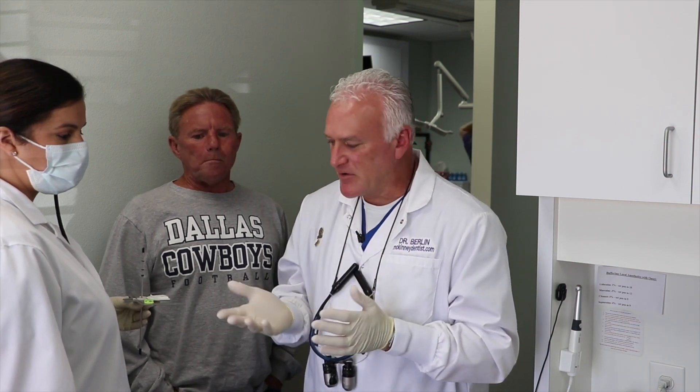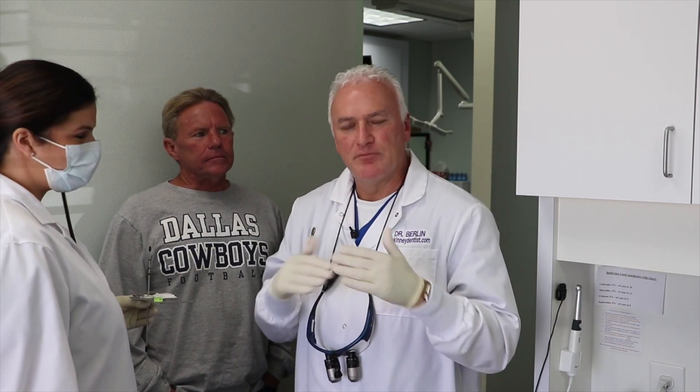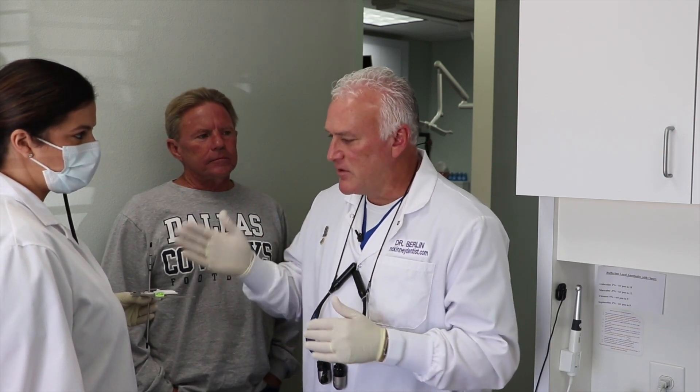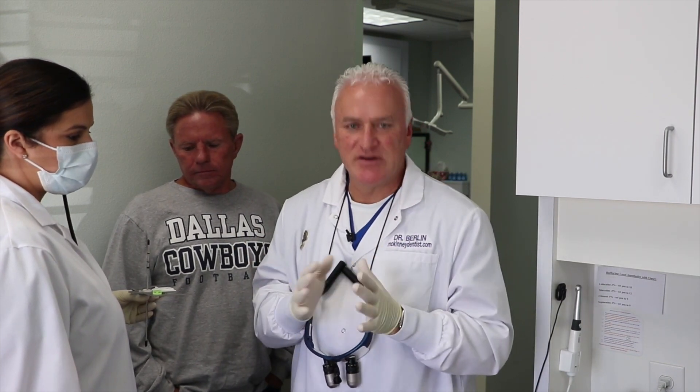What we're going to do is get a little putty material and set it up against his prepared teeth on top. We're going to hold it in place, make sure it's level and parallel — the plane is parallel with the pupils of his eyes. And then there's a little vertical that I want to go right down the middle of his nose. We're going to position that as the material sets up.